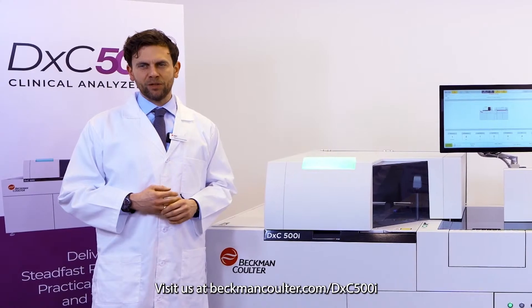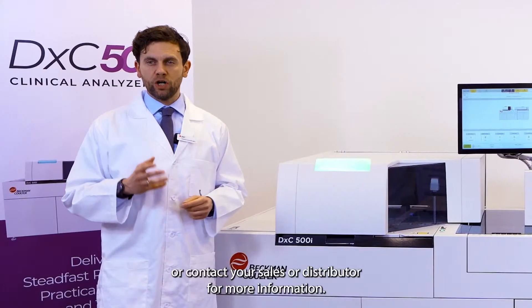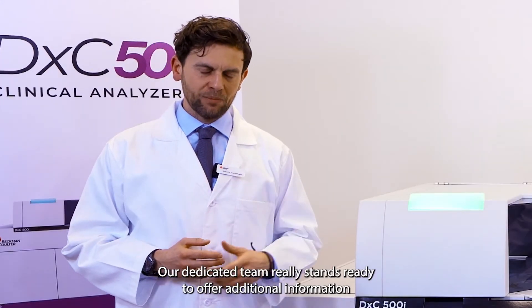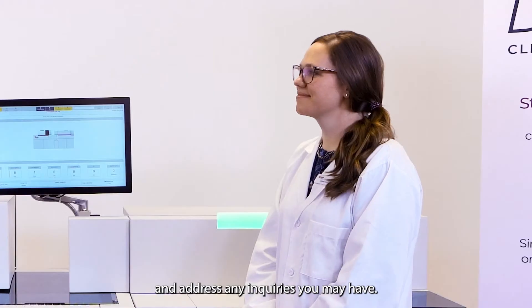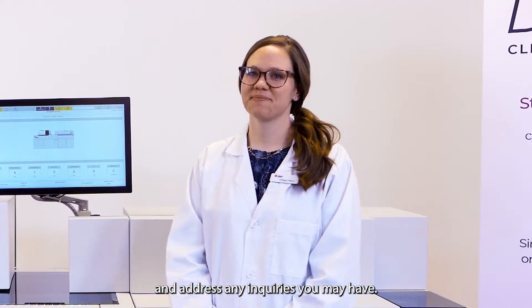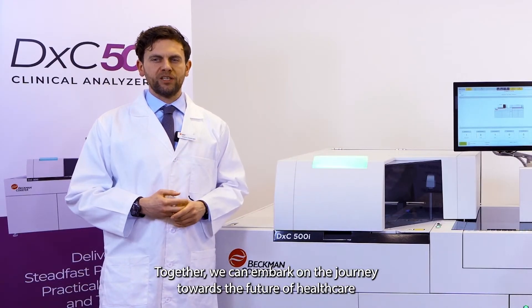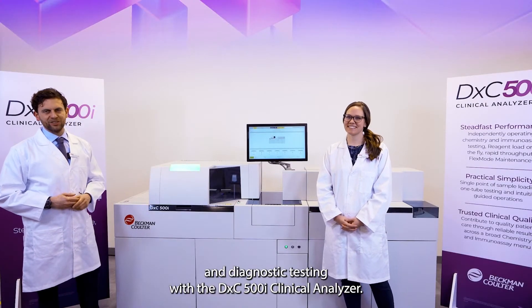We invite you to uncover how the DXC 500i creates flexibility to drive productivity in your laboratory. Visit us at BeckmanCoulter.com/DXC500i or contact your sales representative or distributor for more information. Our dedicated team stands ready to offer additional information and address any inquiries you may have. Together, we can embark on the journey towards the future of healthcare and diagnostic testing with the DXC 500i Clinical Analyzer.